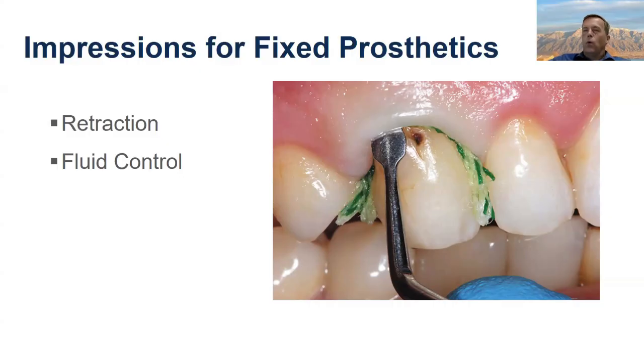So I think one of the goals that we need to have to get really nice margins is that you need to be able to see a gap between the margin and the tissue. Now, I know that there have been many, many studies that say that dentists like one cord, labs like two cords, and potential recession can occur with a double cord technique.